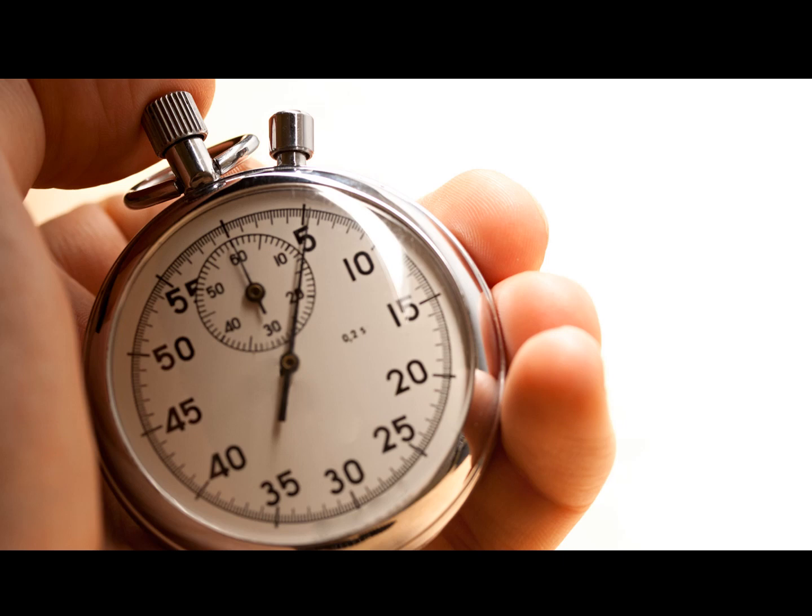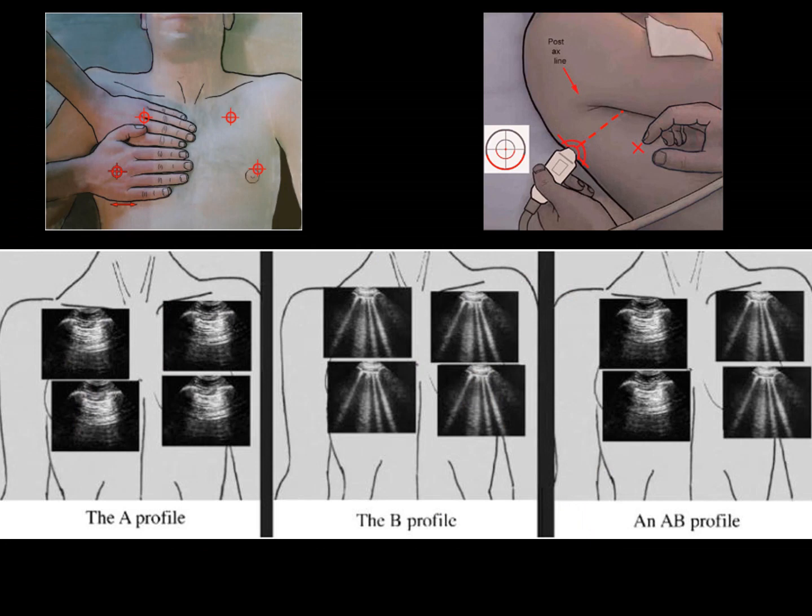Now we will discuss how to incorporate thoracic ultrasound into a standardized rapid approach to the bedside diagnosis of respiratory failure. To do this, turn on your ultrasound machine and place the probe at the upper and lower blue points. Identify the ribs and pleural line. Search for lung sliding, A lines, and B lines. Then place the probe at the PLAPS point and look for consolidation and pleural effusions.